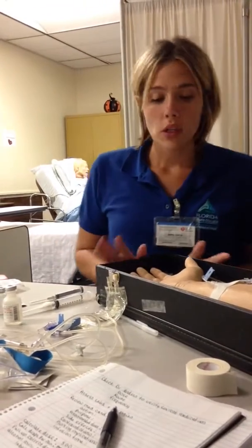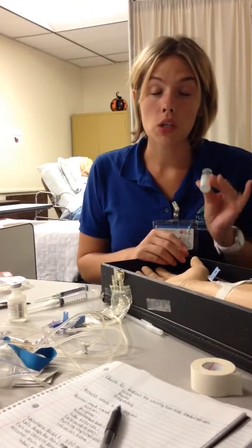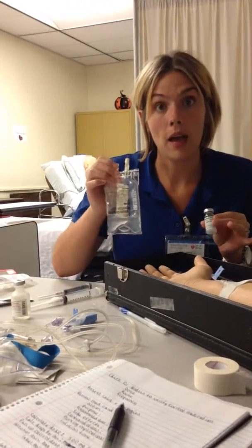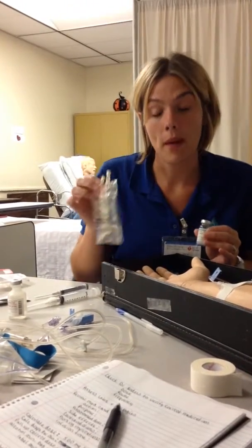Alright, what I'm going to do is, the medication that has been ordered was 500 milligrams. The pharmacy has sent me a vial that reads 250 milligrams per mL, and my order is 500 milligrams. So I will be drawing up 2 mLs of 250 to equal 500 milligrams. I'm going to insert that into my 100 mL mini bag and hook it up with my tubing over an hour for my patient.